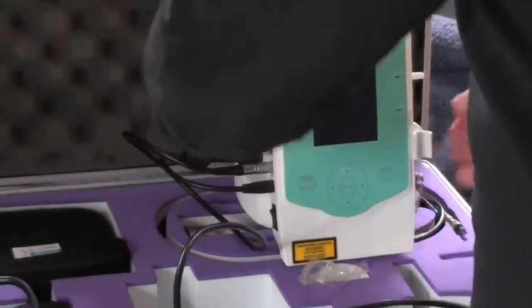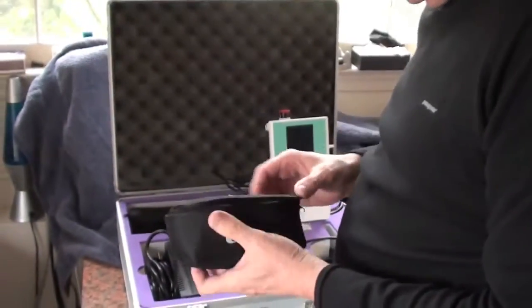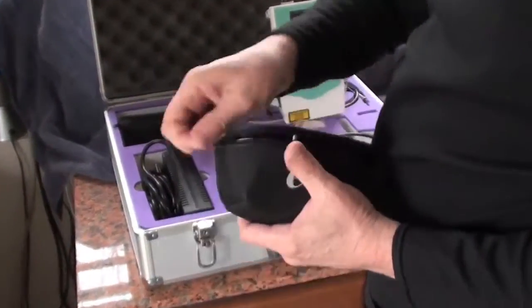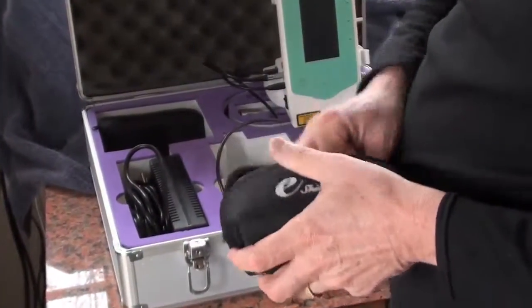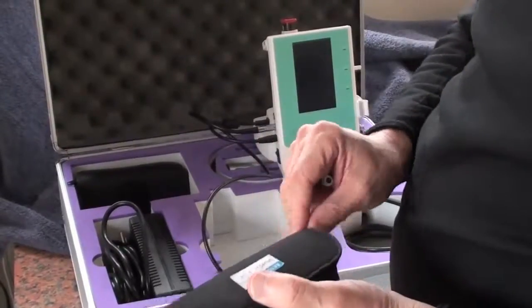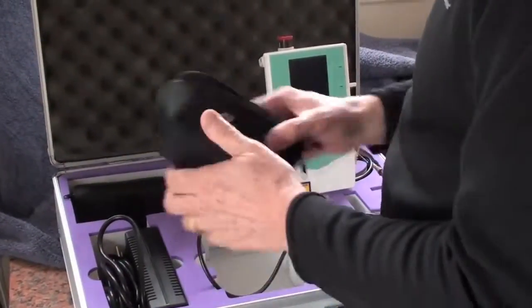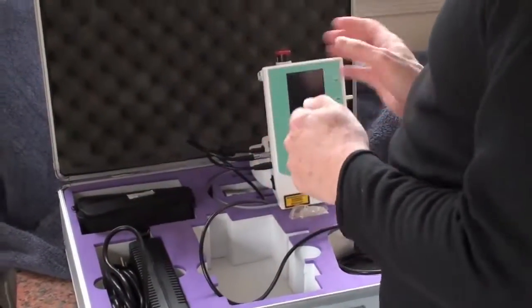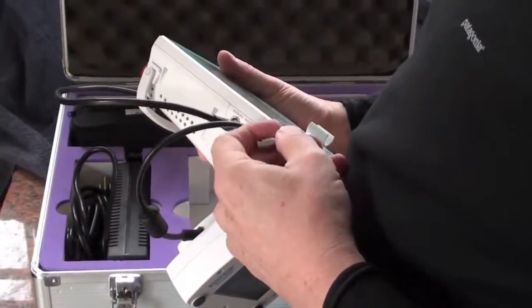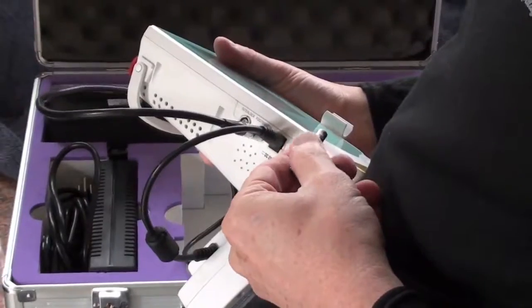Now I recommend that you need the interlock. And you notice how this is marked. The interlock should be in here if the person put it back. And they did. Here's the interlock. Always keep it in one of the kits and mark it. You can even write the word interlock on it, because if you lose this, the laser will not work. We do have them, but it takes time to get them if you lose it.